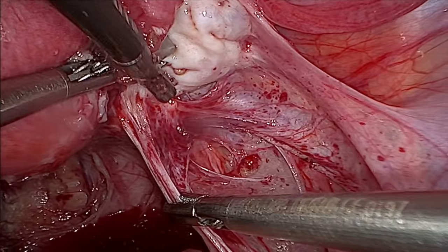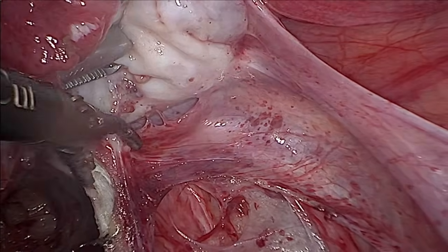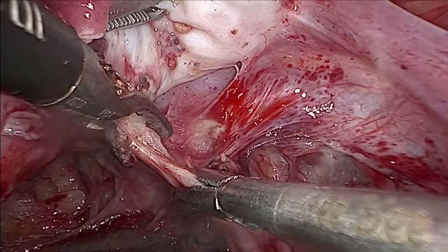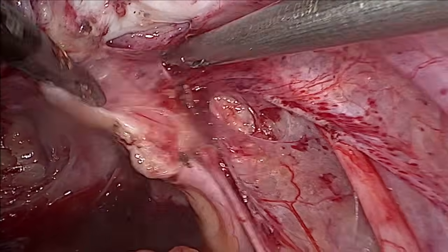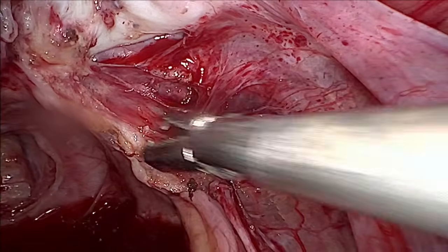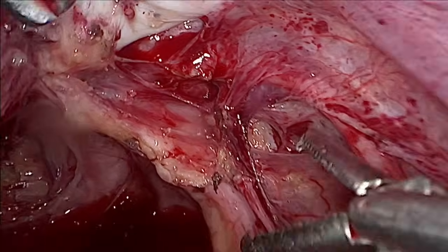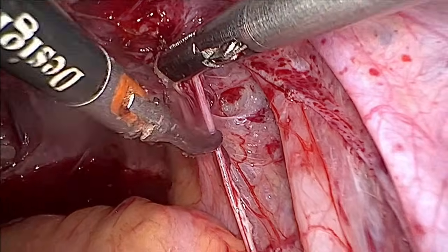Yes, okay. Now we can very well see. Yeah. Now this is a nice traction. Okay. I have released this adhesion from here. Okay, this one. Yeah, and now I can come back a bit. Okay, yeah, and we can just try to remove this peritoneum off.